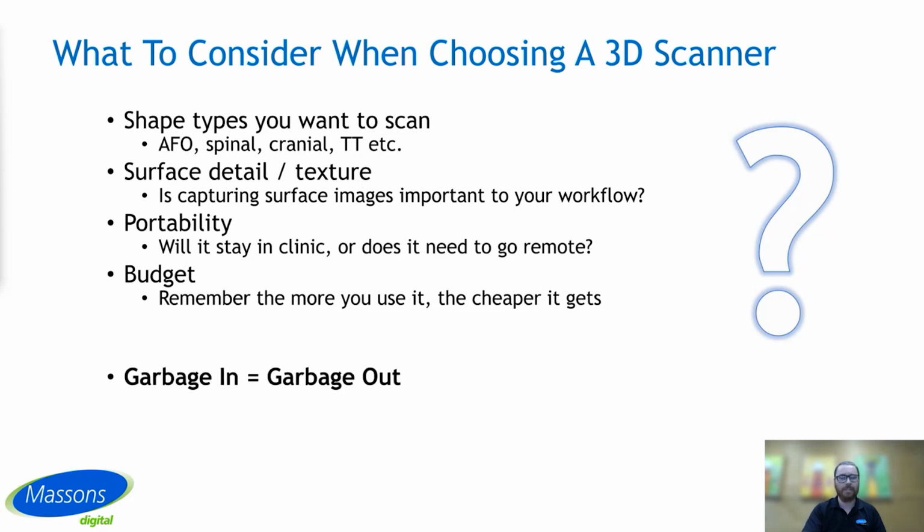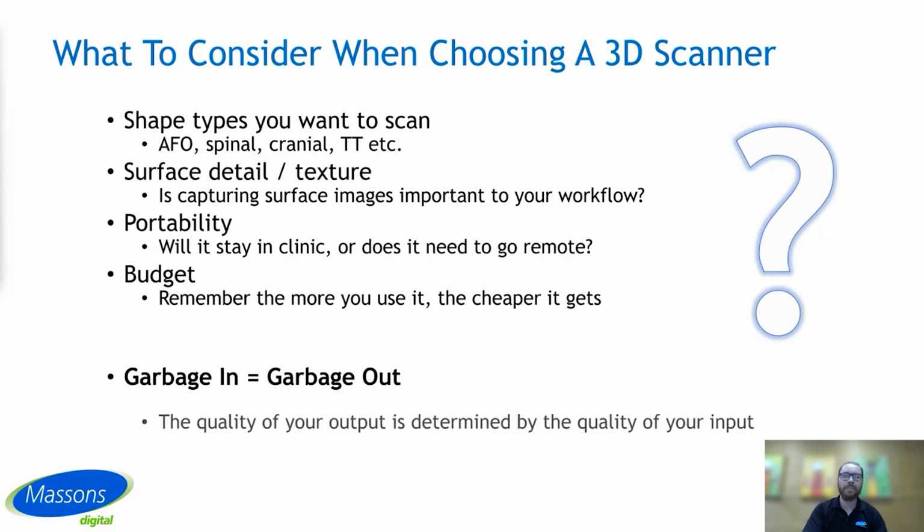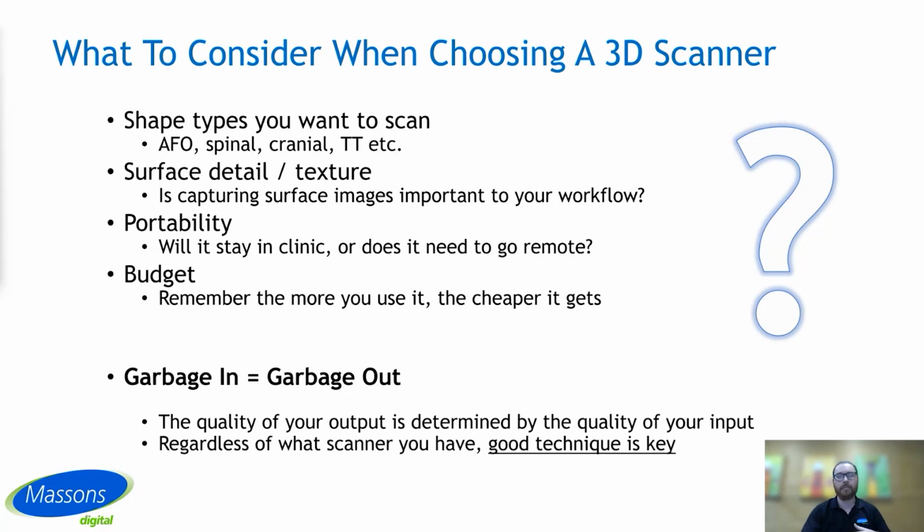Regardless of what it is you're doing, garbage in is garbage out. It's a very standard engineering principle, but it always applies to 3D scanning. So all that really means is the quality of your output is determined by the quality of your input. It really doesn't matter how much money you spend on a scanner in terms of, say, quality or things like that. But regardless of what scanner you have, if you don't invest the time into learning and practicing, it might effectively become an expensive paperweight for you. So always keep in mind, you need to practice and invest the time to get good at scanning and understand how it works and how to succeed so that you can get the best outcomes for your patients and also the best experience for yourself.